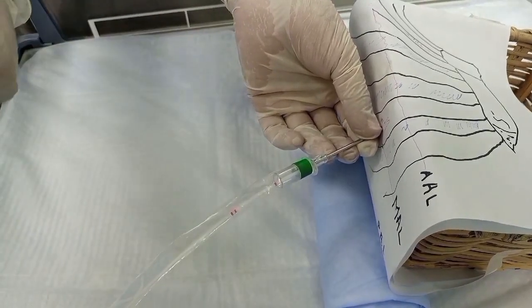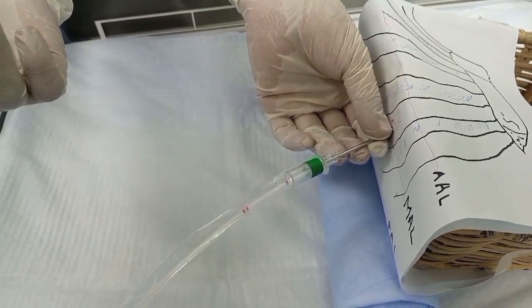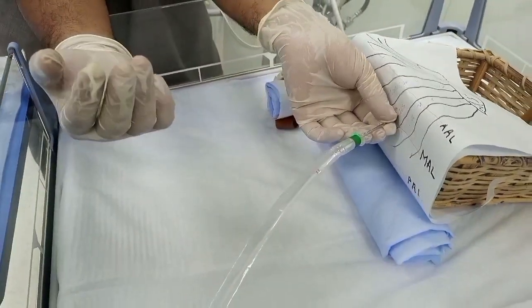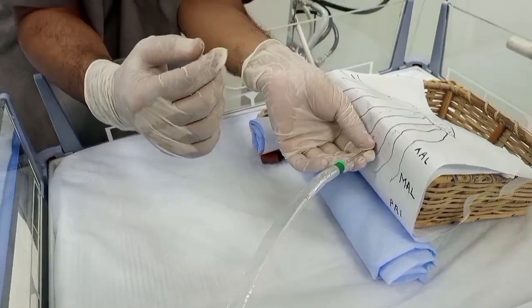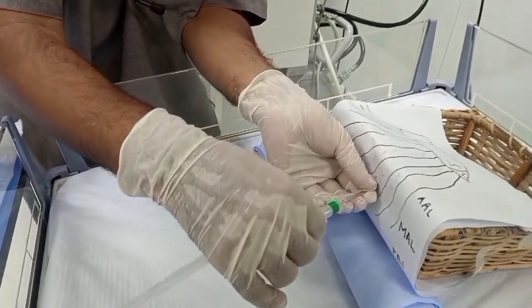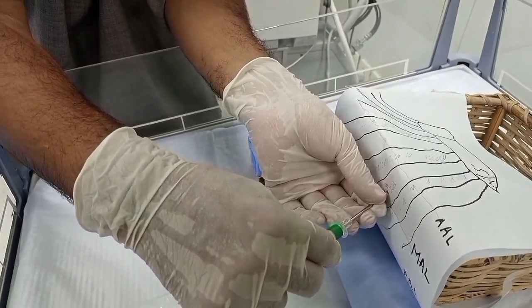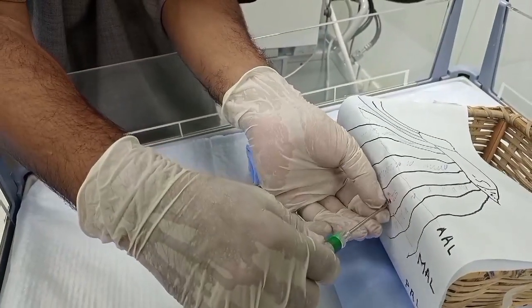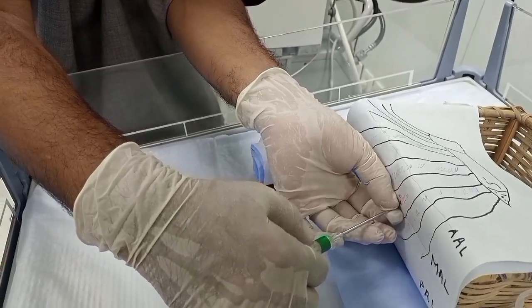Push the catheter forwards three to four centimeters in babies more than 1.5 kg, and two to three centimeters in babies less than 1.5 kg. After insertion, pull the needle holder back and have your assistant hold the catheter in place.